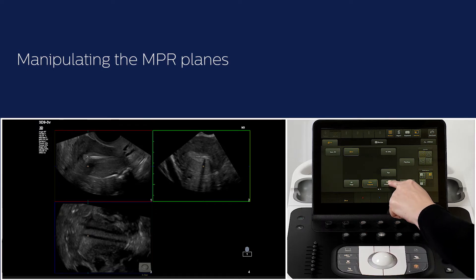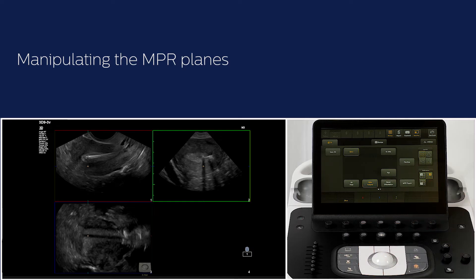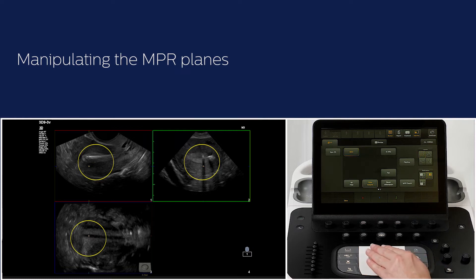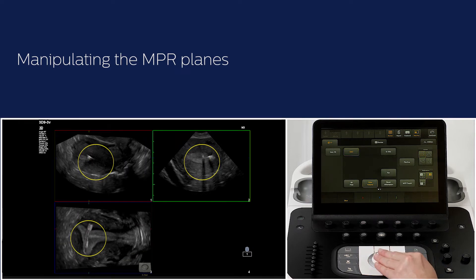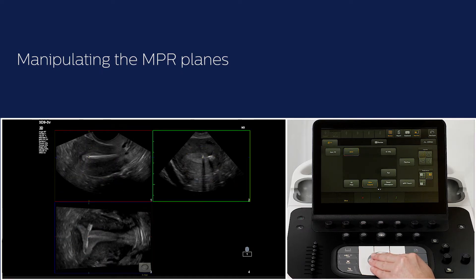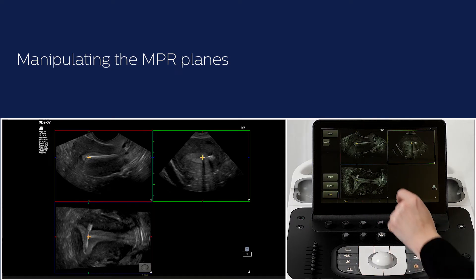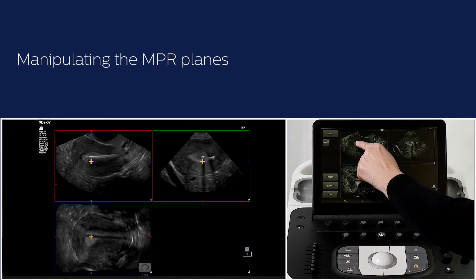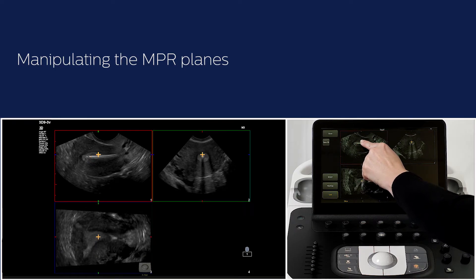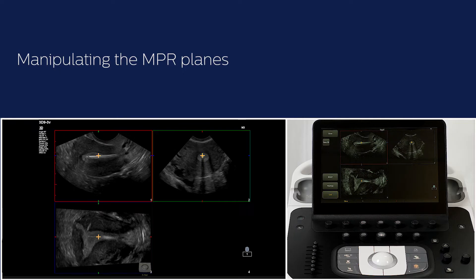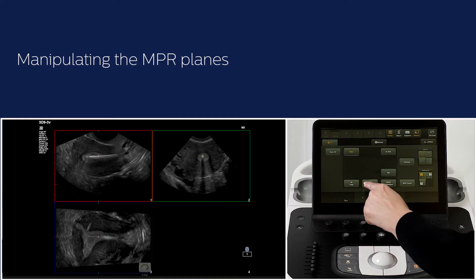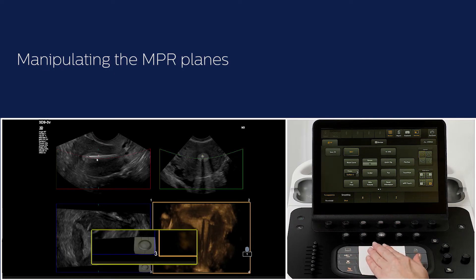At any time, you can press Reset Orientation on the touch screen to return to the original orientation. To see an area of interest in all three MPR planes, move the cursor with the trackball to the area of interest. MPR Touch can also be used to manipulate the reference cursor on the touch screen. If we did not hide the volume, use the pointer to activate the yellow cursor and move it to the area of interest.